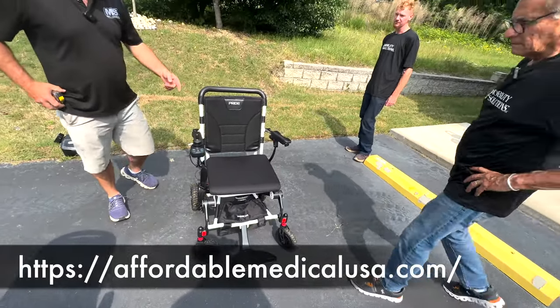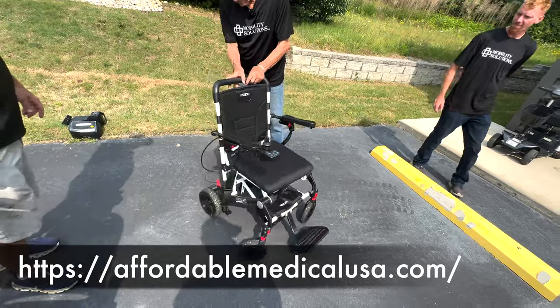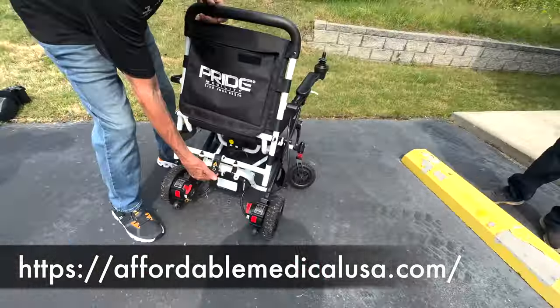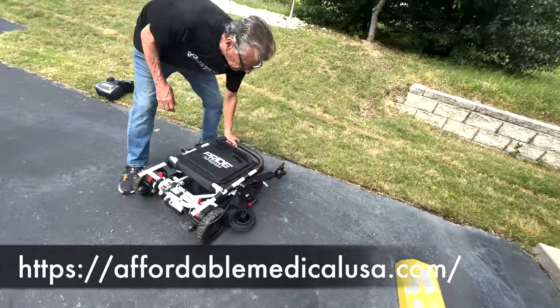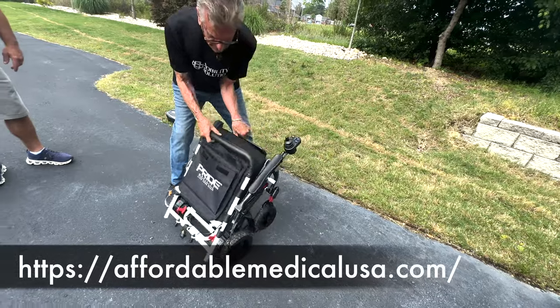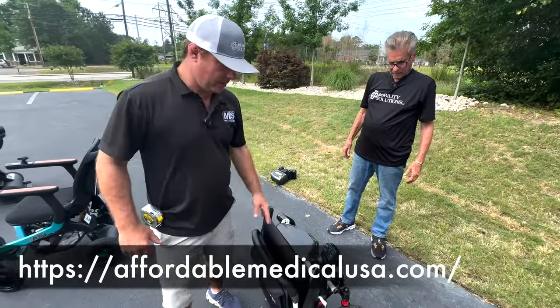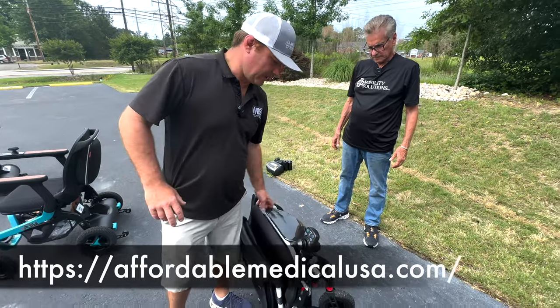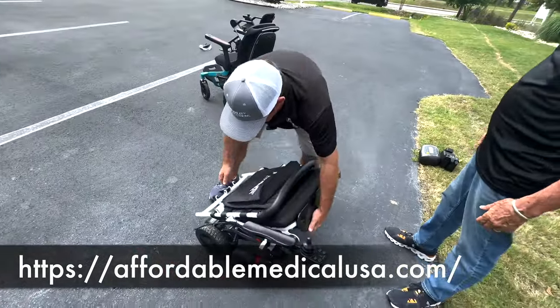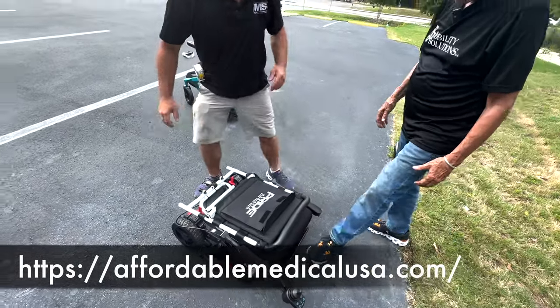Eddie, you know how to do this, don't you? Yeah. Okay, fold this down. This one has a little, just look. Is that it? Yep, you can stand it up. As long as the caster wheels are in, you need to have the caster wheels out when you're riding in this. To pick this up, you can pick it up like this. You can pick it up like this. Yeah. Pick that up for me, Eddie. Tell me how it feels.